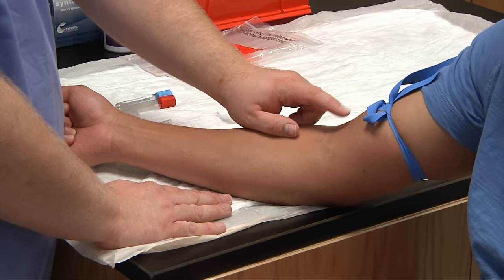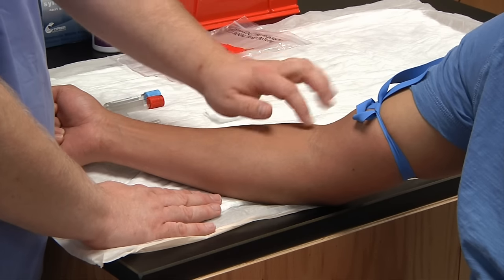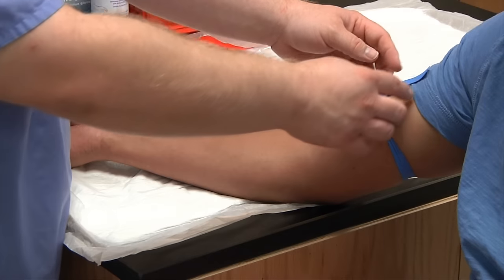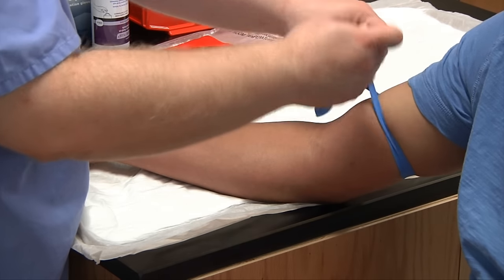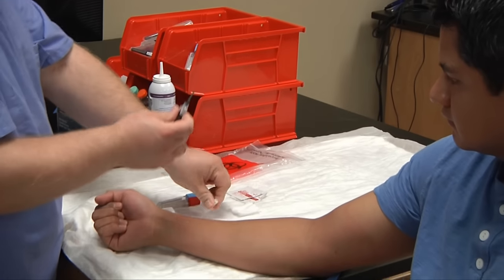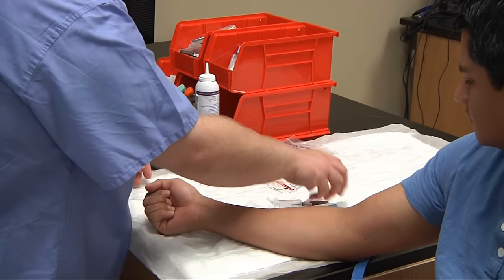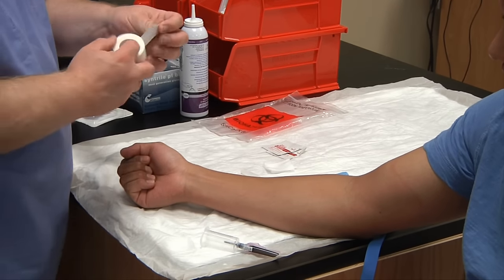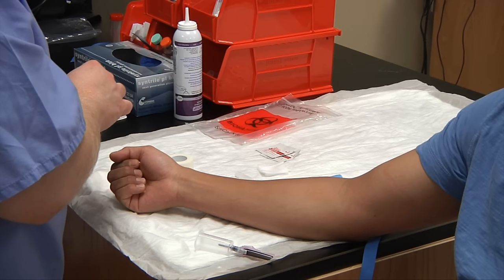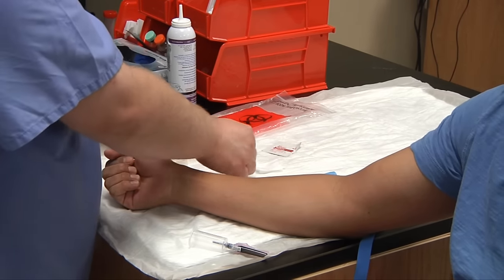I'm going to make sure I have a landmark to determine where I've chosen — it can be a freckle, a mole, a pimple, anything to mark where you're going to stick. If not, you can slightly use your fingernail to make a little indention, which will last about 30 to 60 seconds. I'm going to release my tourniquet as I gather my supplies: assemble all my equipment, unscrew the label of your multi-sample needle, insert it into the holder, tighten it carefully, gather your tubes, and pull out a piece of tape ahead of time. Have your alcohol pads ready and you can cleanse the patient before you put your tourniquet back on.